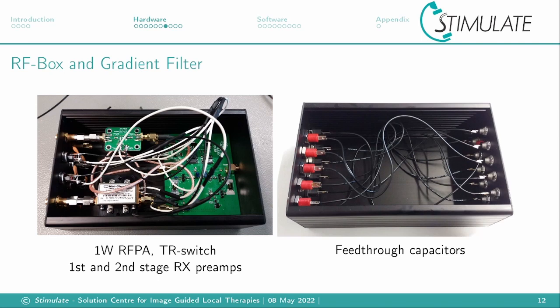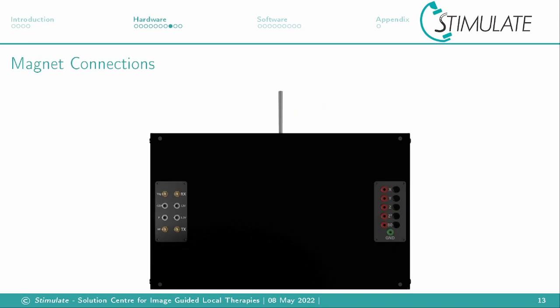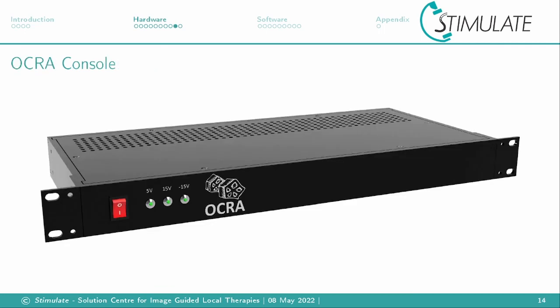The gradient filter box contains the connections for all the gradient channels and feed-through capacitors to shield noise from the gradient amplifier. On the back of the magnet box you have two connection panels. On the left hand side the RF panel for transmit, receive and switching signals, and on the right hand side the gradient channels. The OCRA console fits in a 1-unit 19-inch housing.